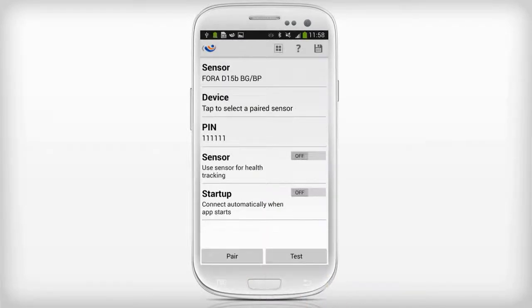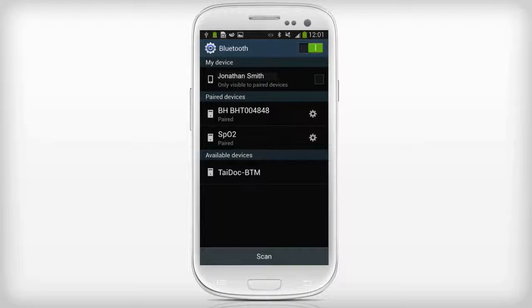In the Fora Sensor Configuration screen, tap the Pair button. The phone will show the paired Bluetooth devices screen.